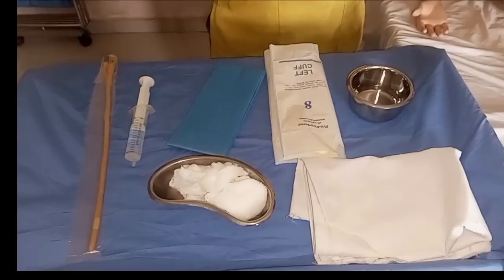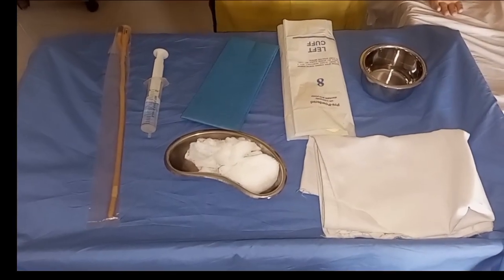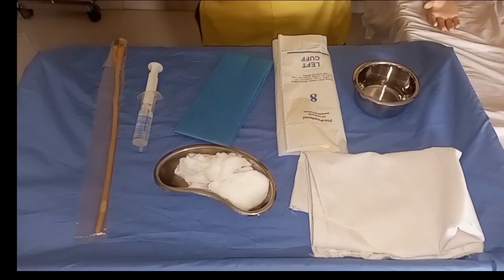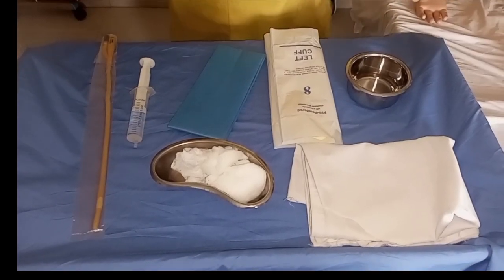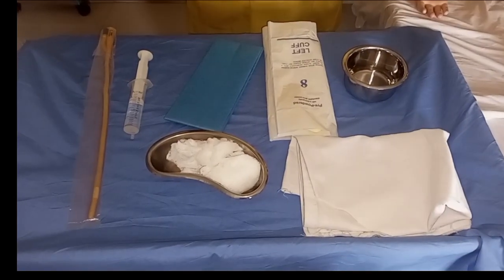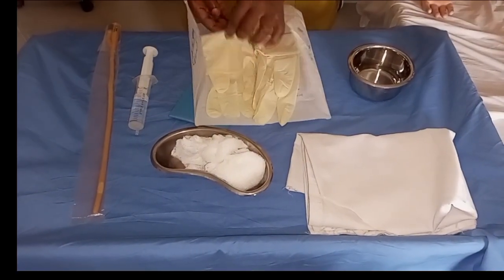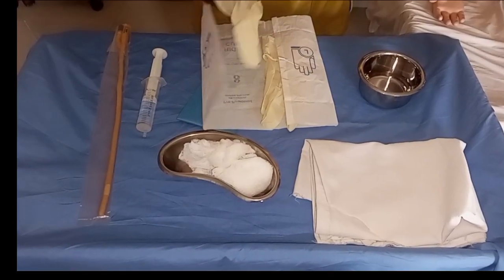The next step is to perform hand hygiene. I have now performed hand hygiene. I'm going to put on my sterile gloves. Remember, catheterization is a sterile procedure. My requirements have been set already.